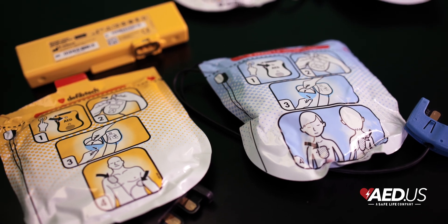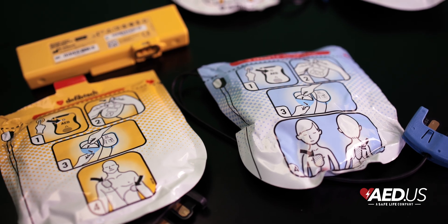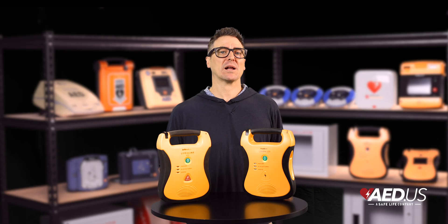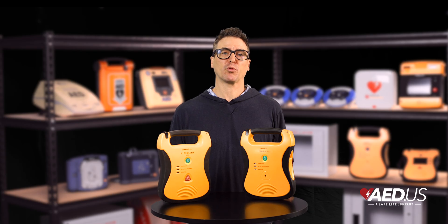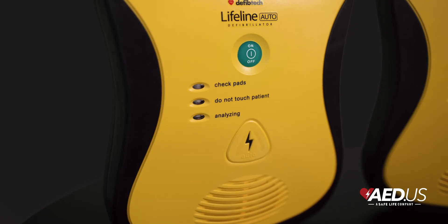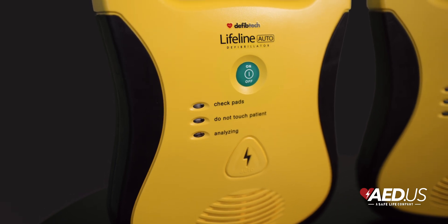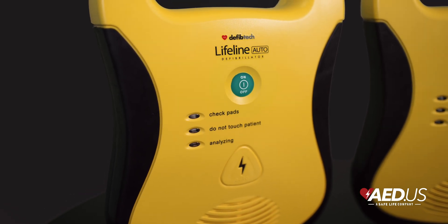For pediatric emergencies, the Lifeline AED can be used with child-specific pads. Once these are connected, the device automatically adjusts its settings to deliver the appropriate therapy for the younger patient. This pediatric capability makes the AED a versatile choice in schools, daycare centers, and family-focused environments.